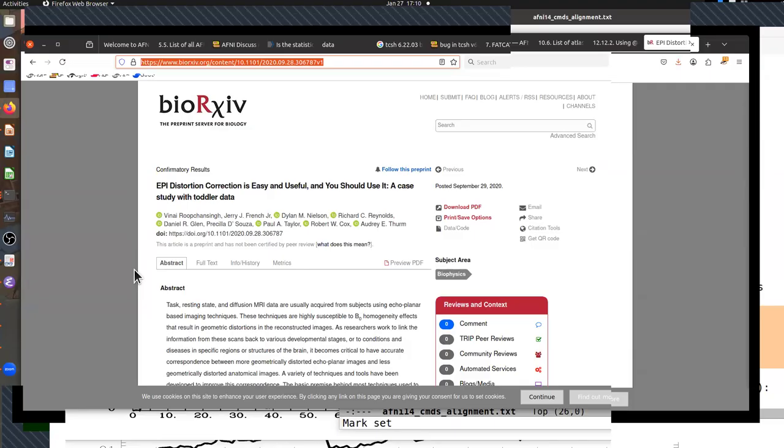Farouk, yeah, nonlinear warps can be concatenated with linear and affine transforms, sure. So 3dQwarp, for example, inherently does that because it will do an affine and then refine it with nonlinear, and you can glue those together. You can glue in other affines. You can glue in multiple nonlinear warps. Things just get a little slower depending on what's concatenated, what's being done.